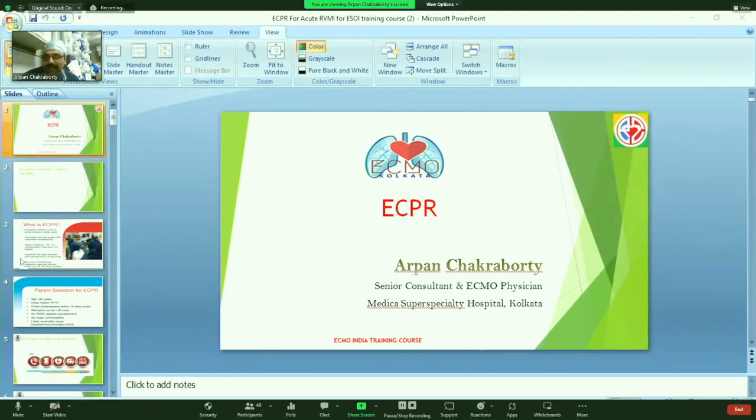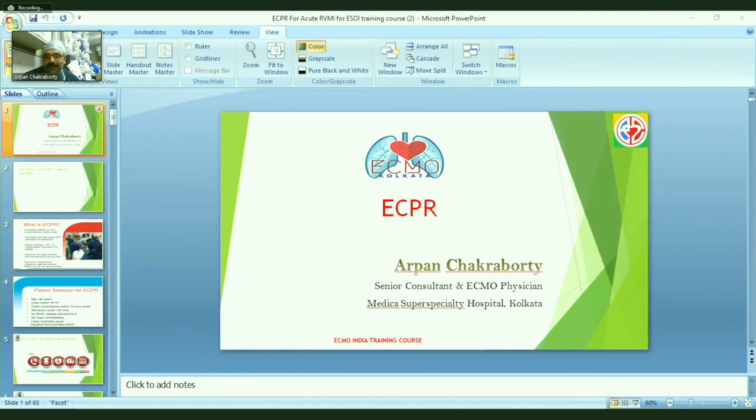So with that thing, we are starting this ECPR lecture, and obviously we don't have any conflict of interest or financial disclosure, but I'm very much interested in the awareness of ECMO. So what is ECPR? We know ECPR is emergency initiation of the ECMO during refractory cardiac arrest.